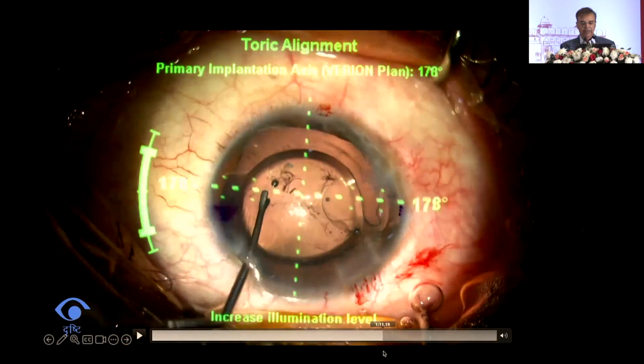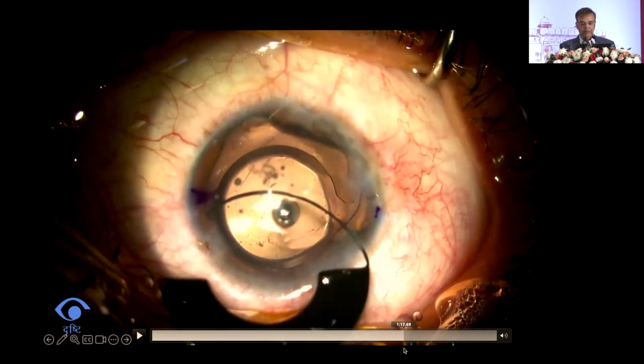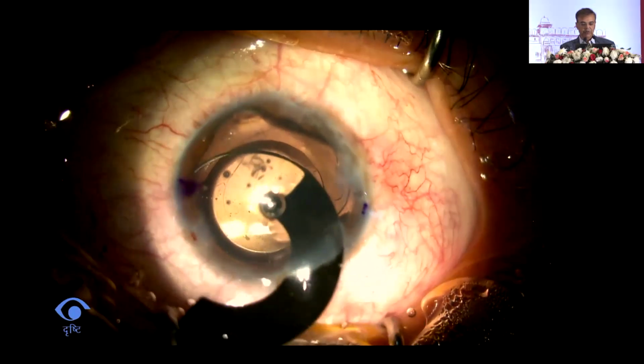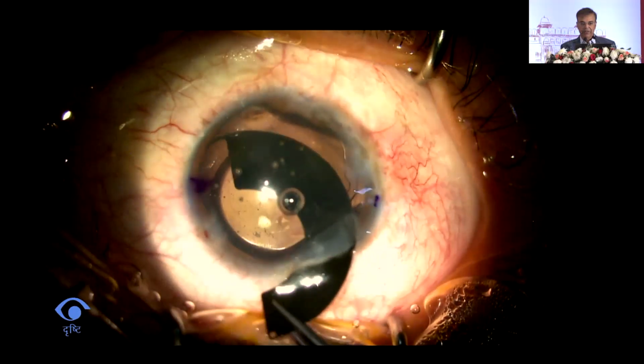The cataract was out in a few seconds. It's a soft cataract, and then we implanted the lens. It was a toric lens which we implanted. Now there was a dilemma in the mind, because these implants require a slightly bigger incision than the 2.2 which we are used to, so you have to increase it to about 3.5, otherwise they don't go, and they are brittle and friable.